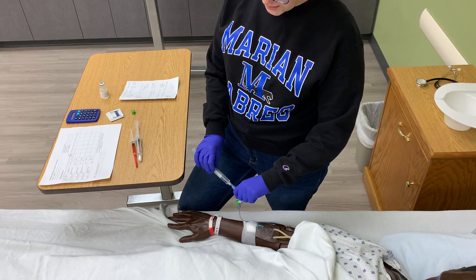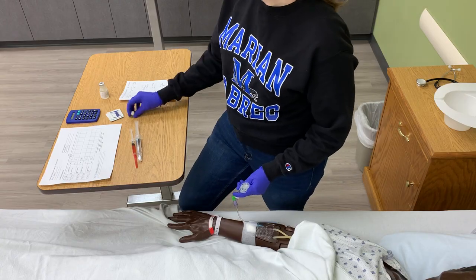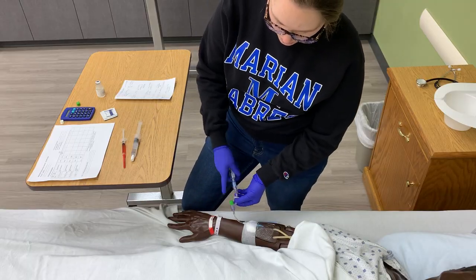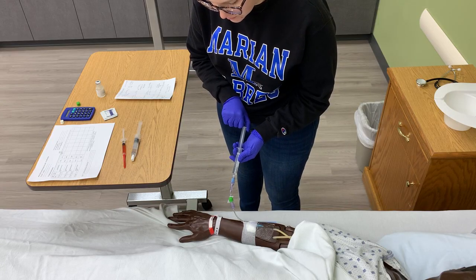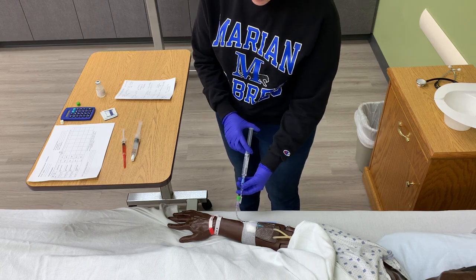And we're going to attach our flush. Okay. I'm going to unclamp, and I'm going to aspirate. So aspiration allows me to assess for blood return. Okay, and I do see blood return. You only need about half an ml or so.